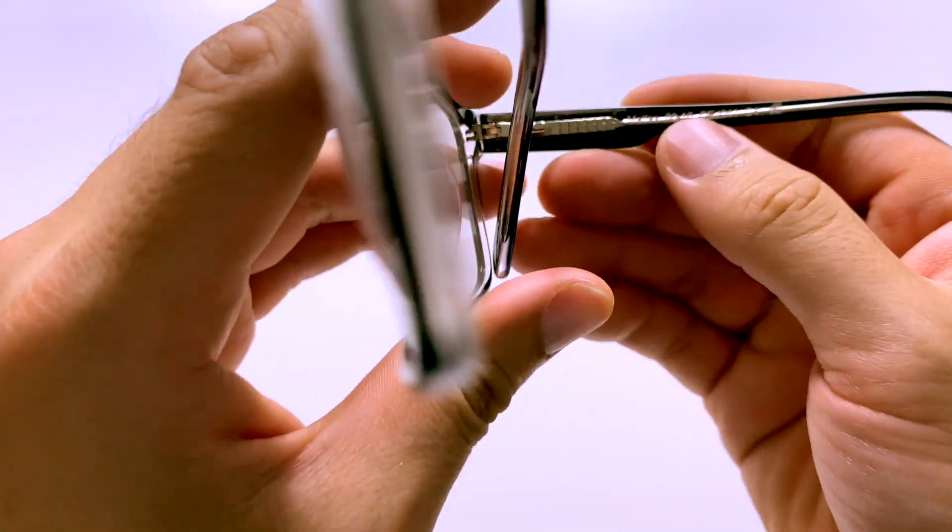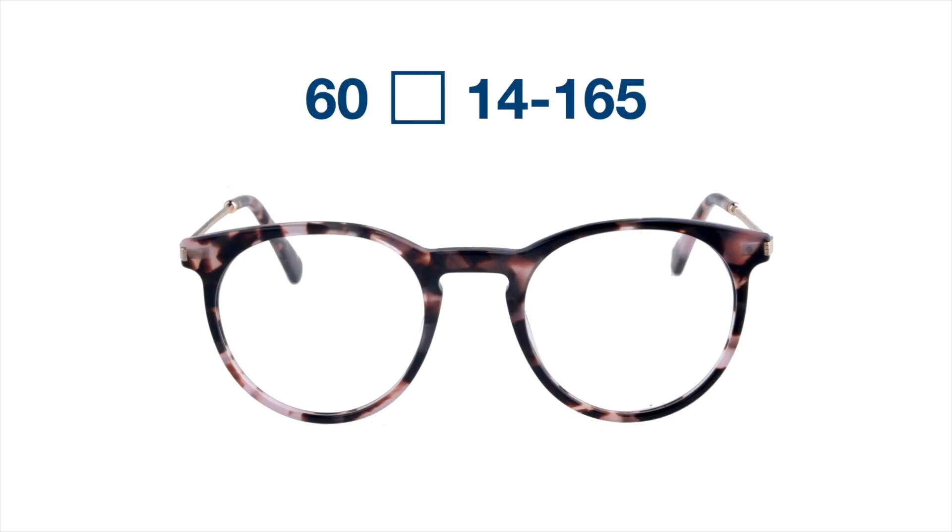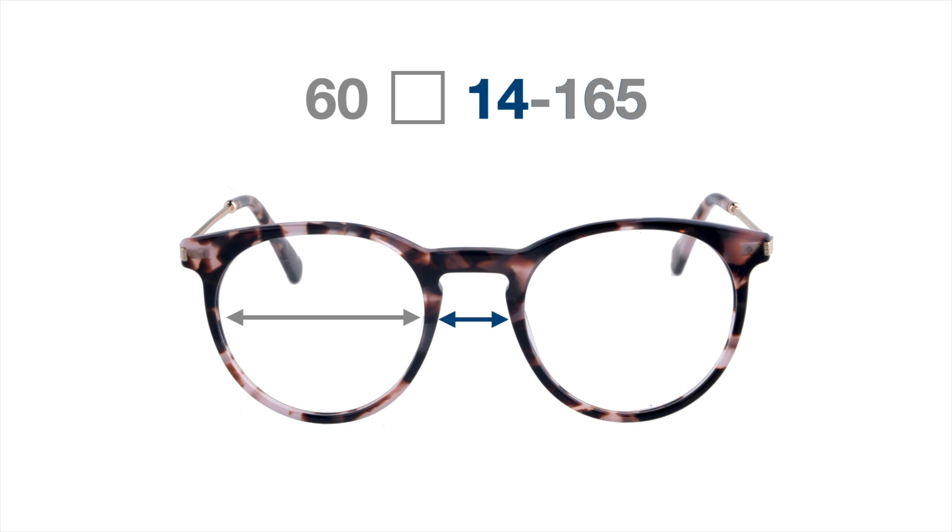When we look at the measurements of the glasses, the first number represents the distance between the outside of the lens to the inside. The second number represents the distance between the lenses, or where your nose bridge is, and the last number represents how long the arm is.